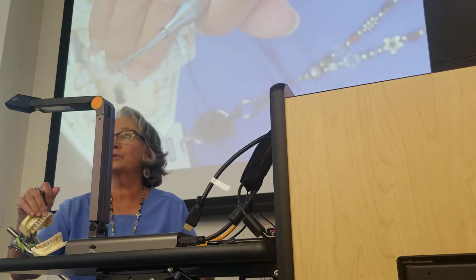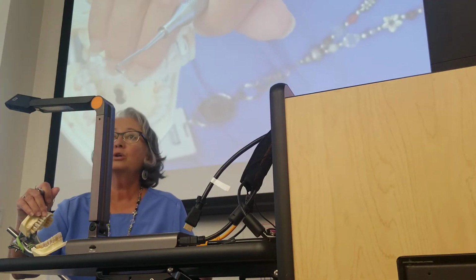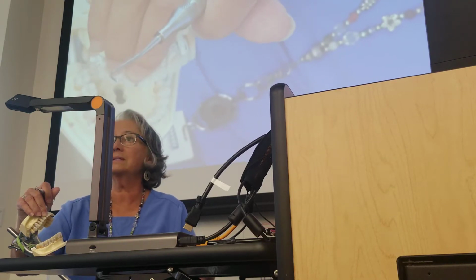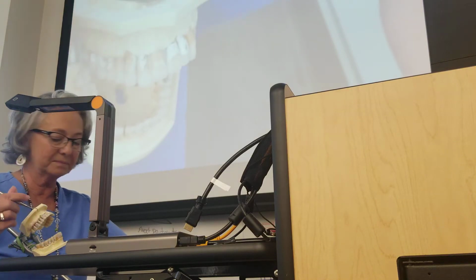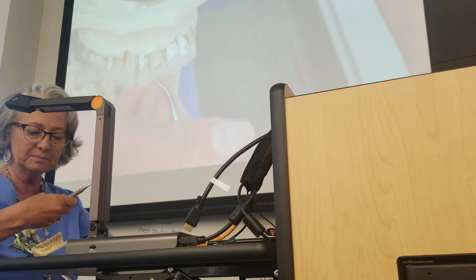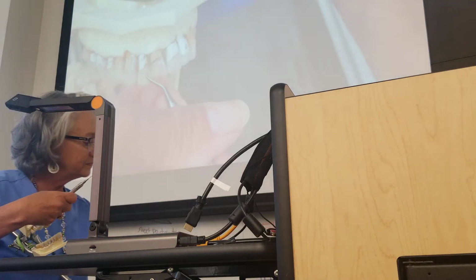Right-handed people, we're gonna do surfaces away. Left-handed people, we're gonna do surfaces towards. So where are we gonna sit? We're doing surfaces away if you're right-handed, so everybody's gonna sit at 12. Okay, so select the correct working end and place it in the get ready zone. So we're in the get ready zone.